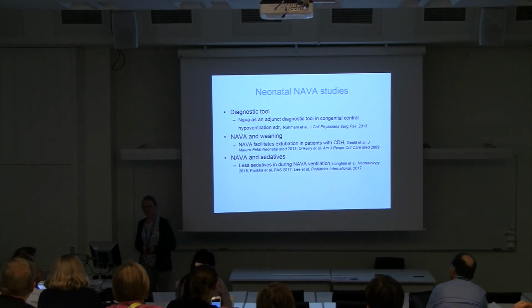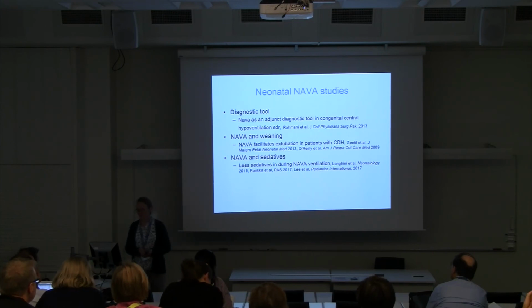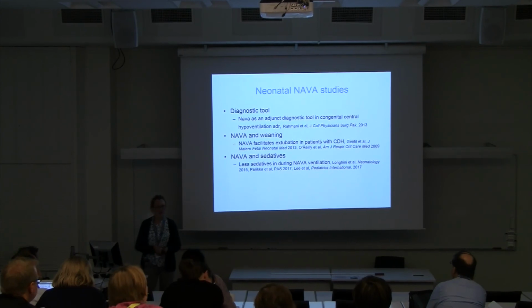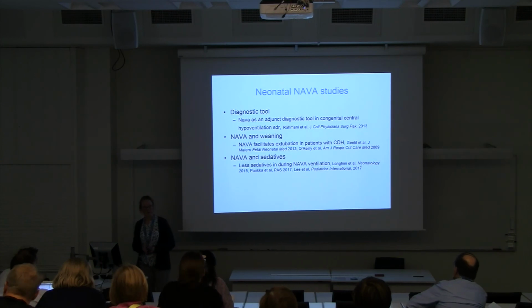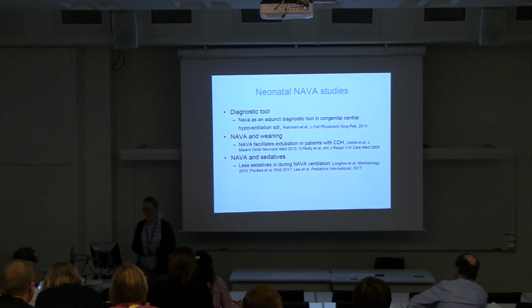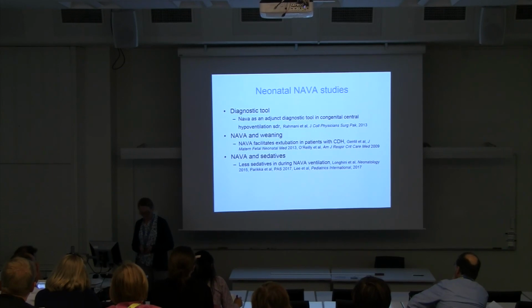NAVA has been used as a diagnostic tool to help in the clinical work. I already mentioned the congenital central hypoventilation syndrome. NAVA has been used to wean difficult patients. Others and we have used NAVA when we wean congenital diaphragmatic hernia patients. And what is quite important is that during NAVA ventilation, which is triggered by the patient him or herself, we need less sedatives.